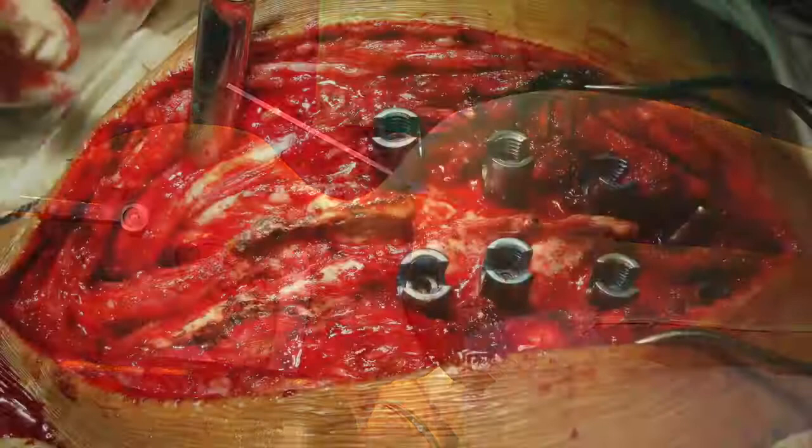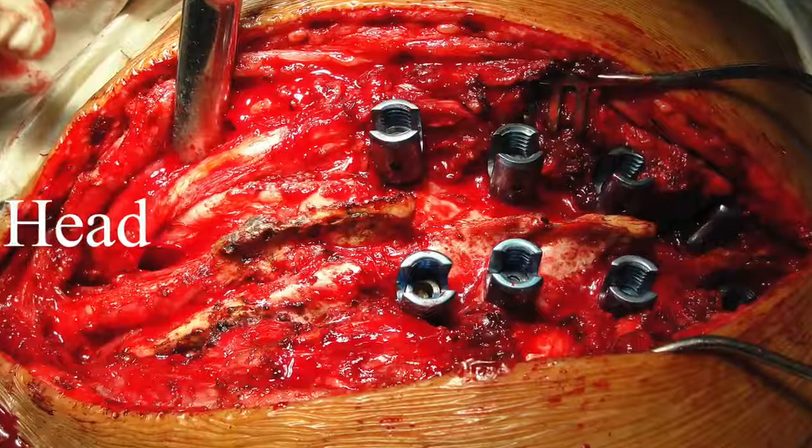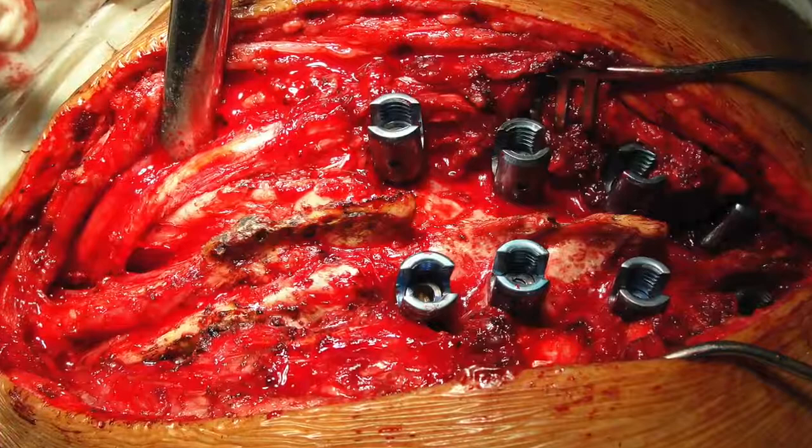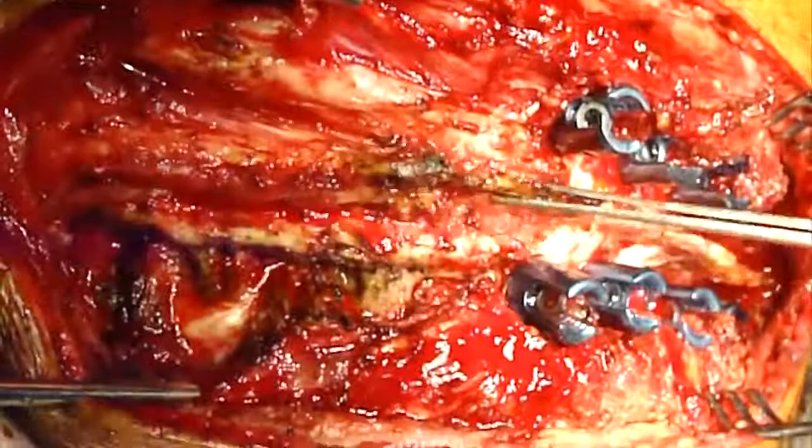A careful exposure of the posterior elements was performed, taking care not to injure the uncovered dural sac. The left side of the screen is the head end and the right is the foot end. The lower thoracic pedicle screws have been inserted from T6 to T9. The meningocele in the cervical region is visible here. A large free-floating spinous process was found at the T4-5 level.